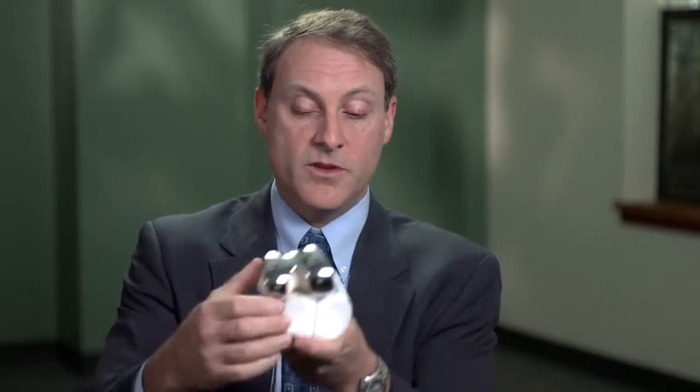Lastly, if you look at the tibial component, this kidney shape is going to match the bone perfectly, whereas with off-the-shelf implants, we have to approximate that.